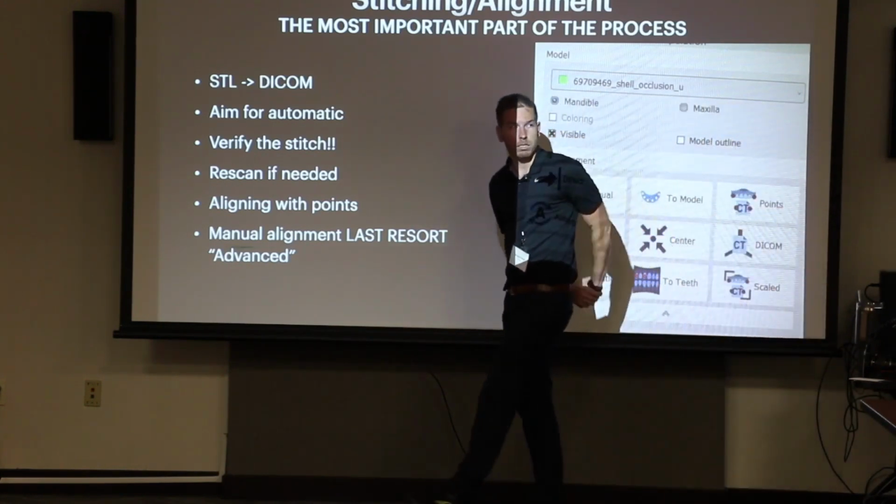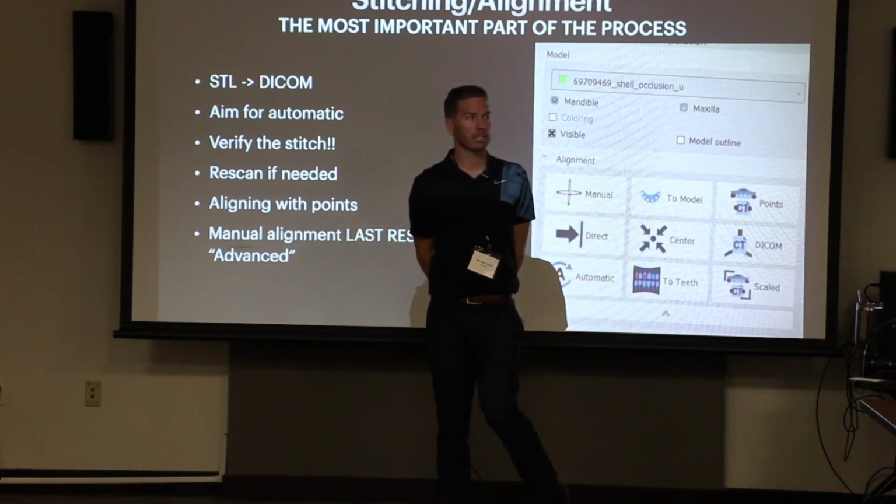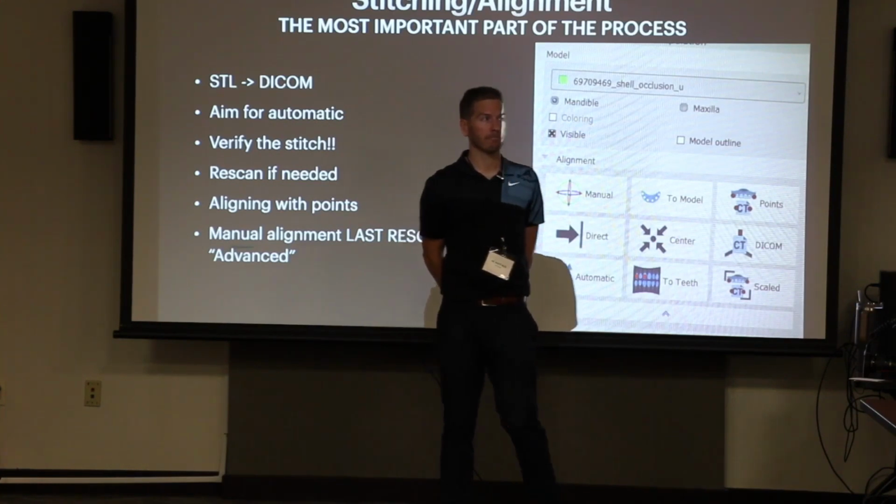You can't use the scan if it takes you 45 minutes to stitch the scans and there's still an aspect that's wrong and you're going for high predictability. We would call patients back before. Come back in, we'll make you a scan appliance, so we need to do something else with the scan, so they appreciate it usually. Yep. It's not a big deal.